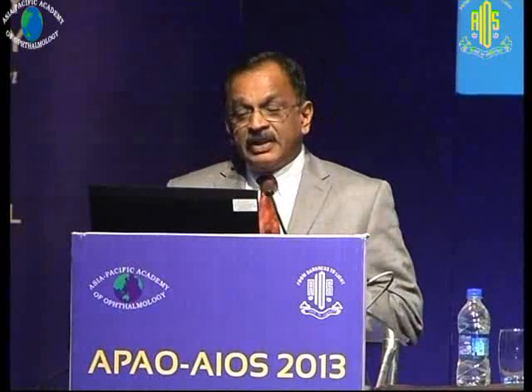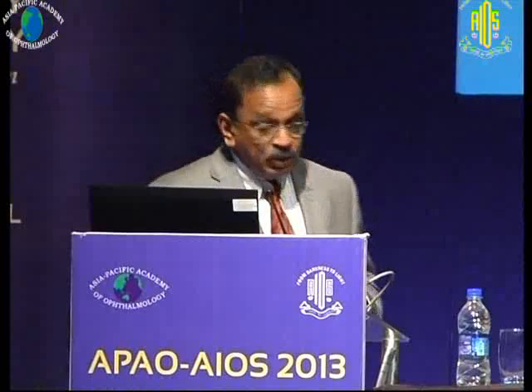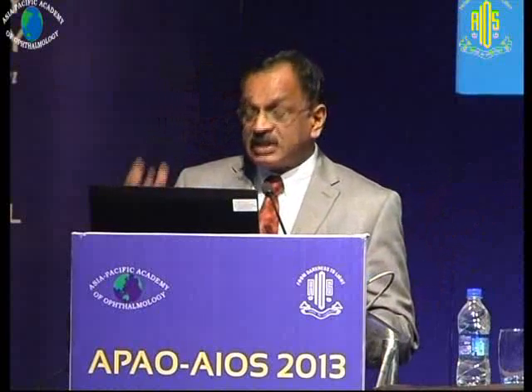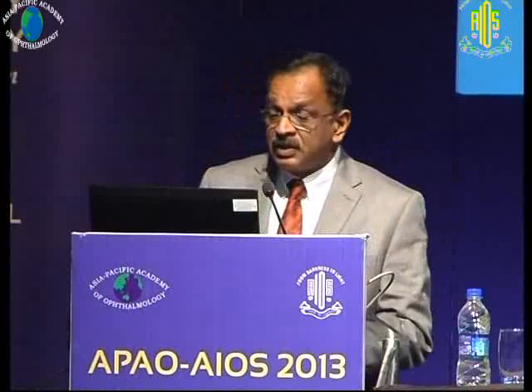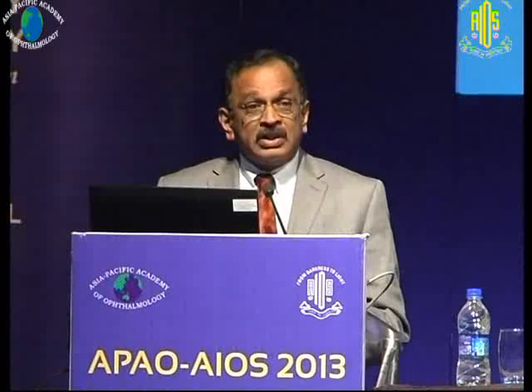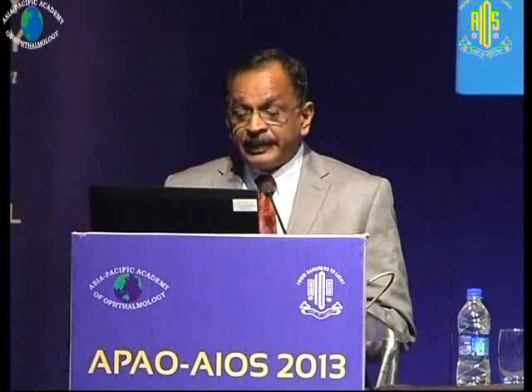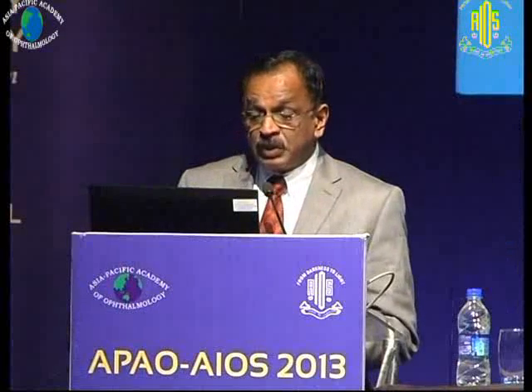When the retinotomy is circumferential, you have to remember that the edges must reach the ora in an acute angle, as you see here, and not like this, because then the chances of lifting are much higher, so you have to have an acute angle with the ora in these cases. Always extend the retinotomy into the healthy retina, not just stop short in the pathological area, to make sure that there is no traction in the edge of the retina. So especially during circumferential retinectomy, at least 1 clock hour you should move into it.